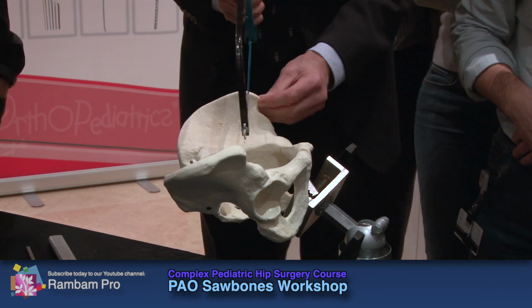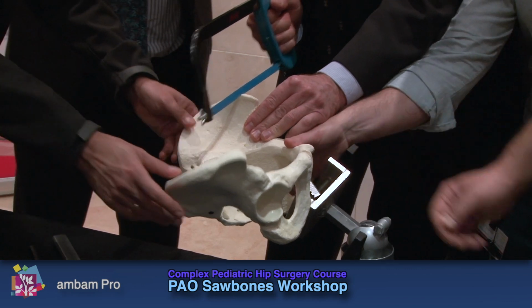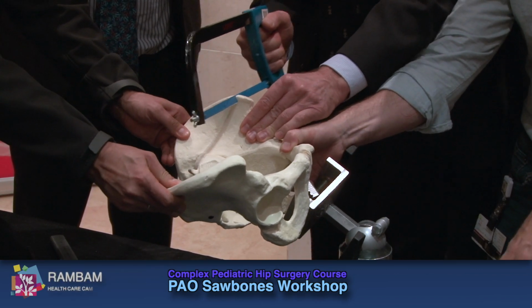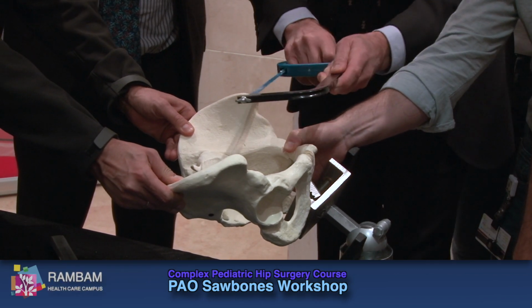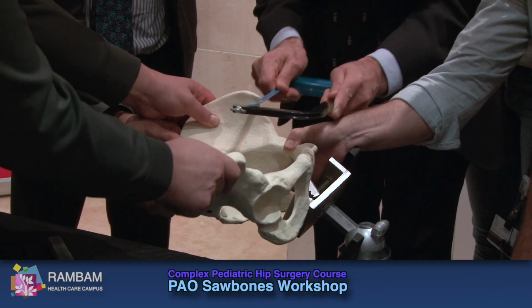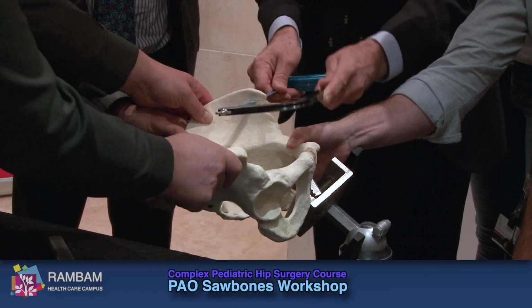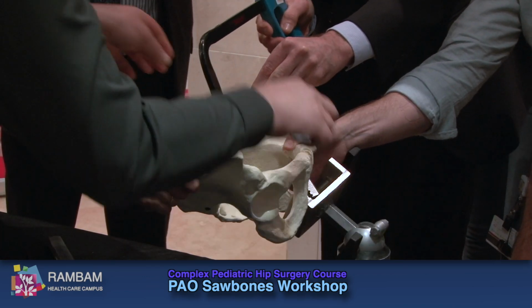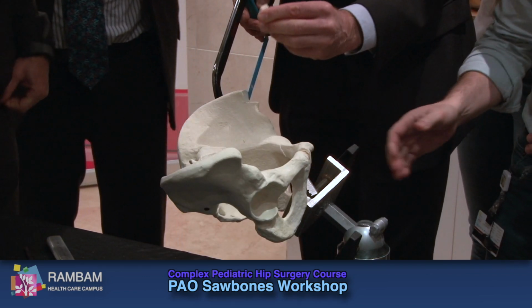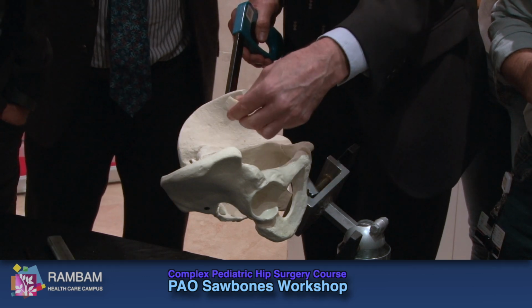The saw cut will be, I mean, this piece has come off, so we've done our osteotomy here. Then osteotomy here, how big a piece do you do? Enough piece to fit it out to the skin, right? So that'll then come this way.